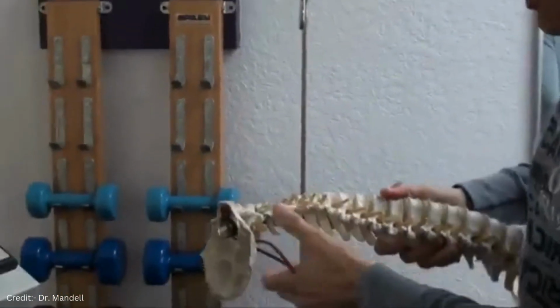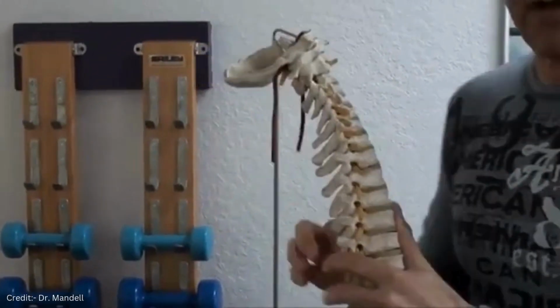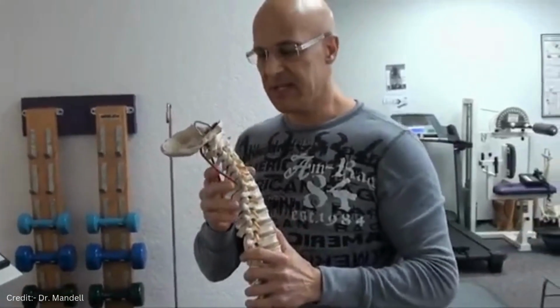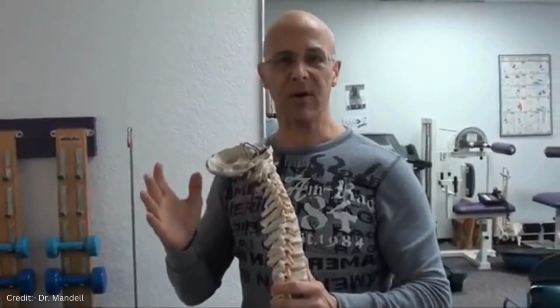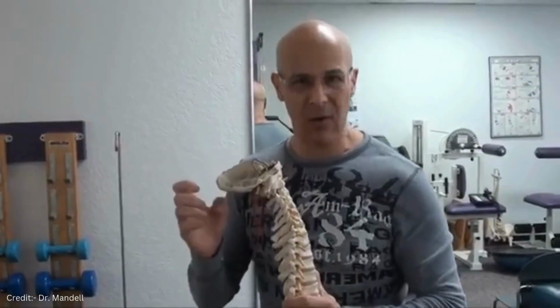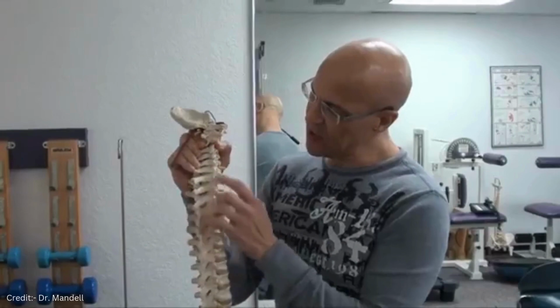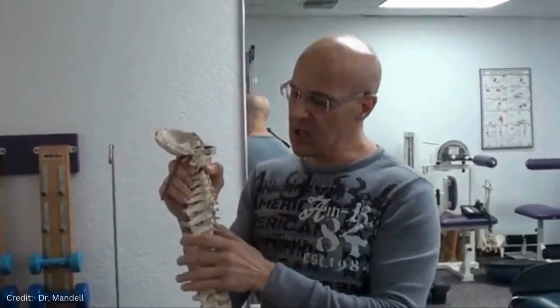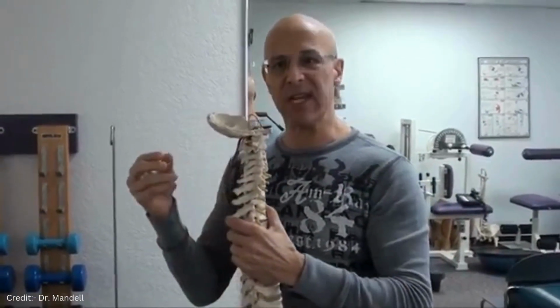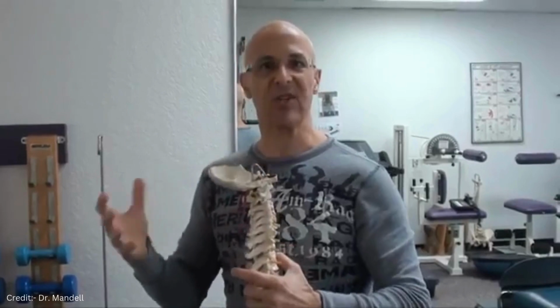Now, when you lay back here, if you just pull the spine straight out and you do not have the proper angle, decompression or tractioning of the neck is all about finding the right angle, because everyone's facet joints, which are the back of these joints right here, are angled a little bit differently. So we cannot standardly tell every patient to do traction the same way.